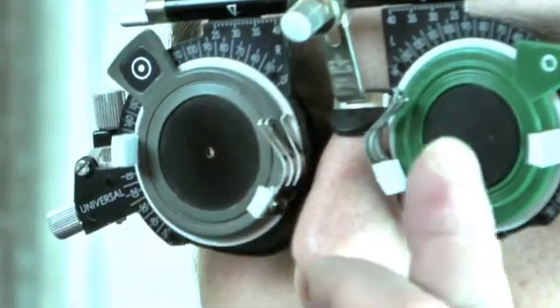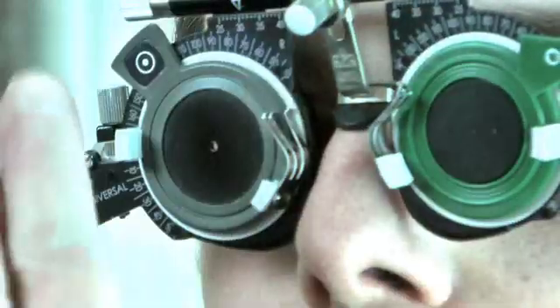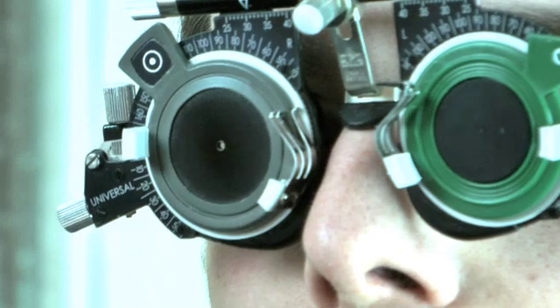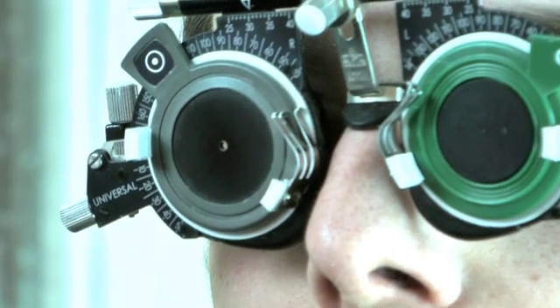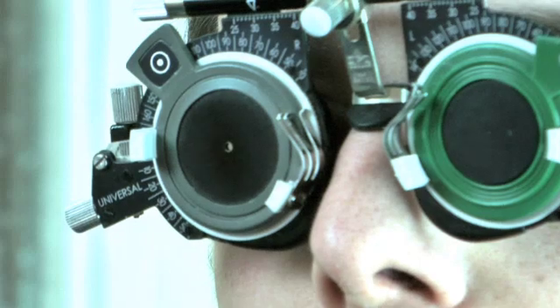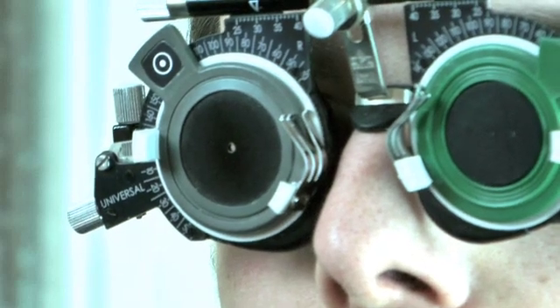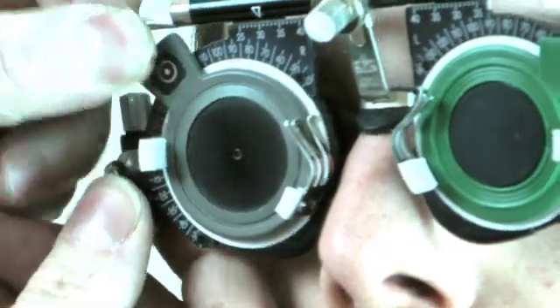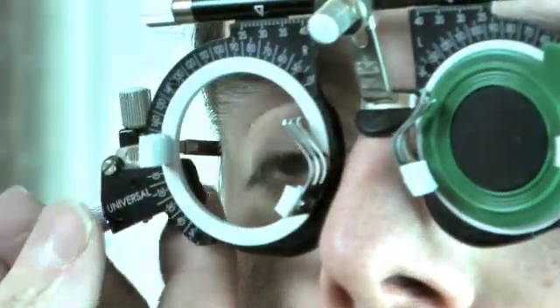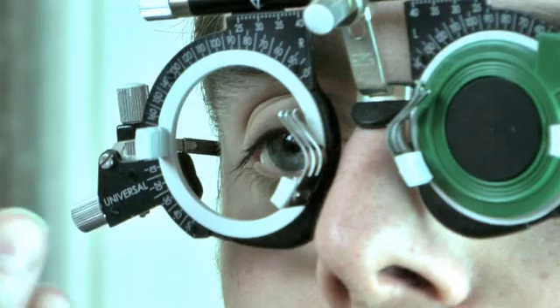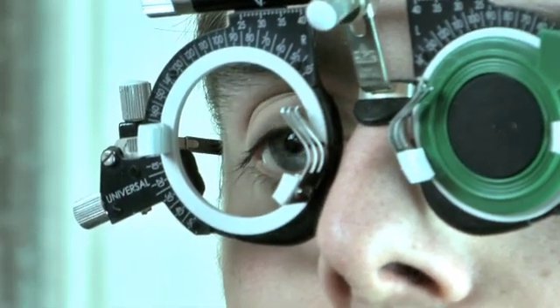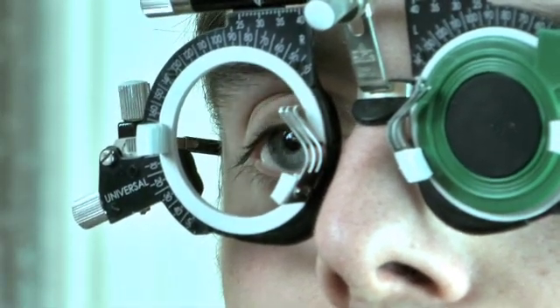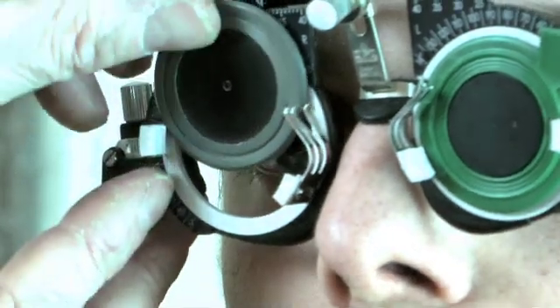He's now got an occluder in the left eye, and the pinhole is now in the right eye. With the pinhole in place, we then ask the patient to see whether it improves his vision. We have to compare his vision between not having anything in the trial frame, and then compare it with the pinhole in place.